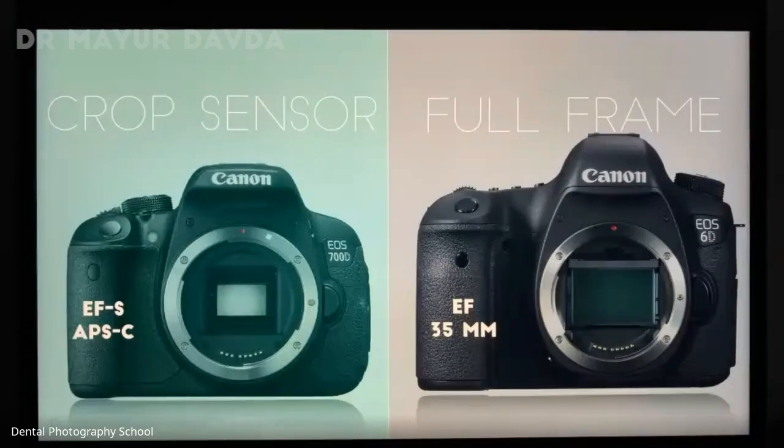So I would say this, don't go for full frame cameras because they are expensive. They don't have an inbuilt flash. It's not really needed. They are very heavy. So you can go ahead with a crop sensor DSLR. All right.